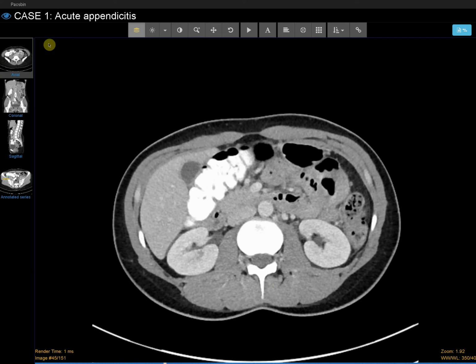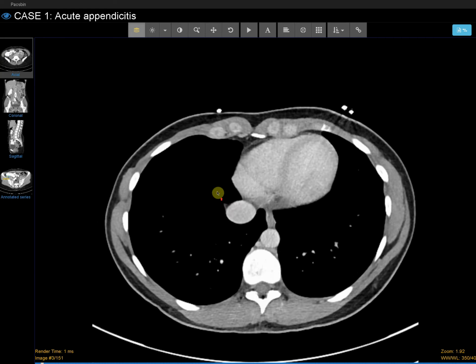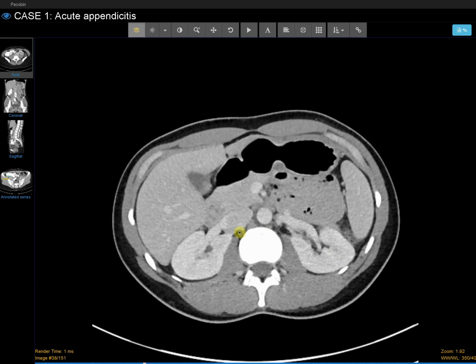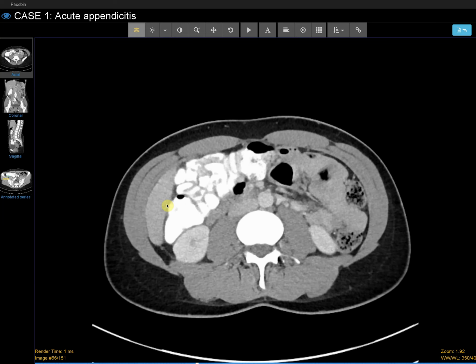The reason I do that is because, let's say the pathology is down in the appendix and I start with the liver, then spleen, pancreas, kidneys, gallbladder, and just follow down. It may be 4 or 5 minutes later that I finally come to the appendix, and by then I'm tired. My concentration and acuity is high in the beginning and it falls down. So I want to provide the maximum attention to the pathology that's already suspected.